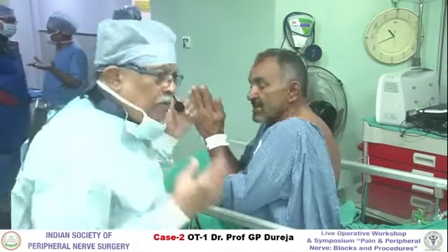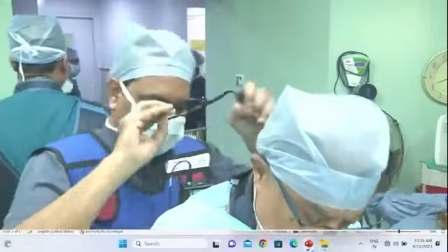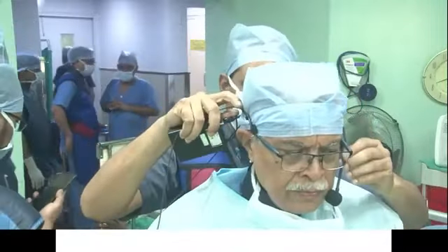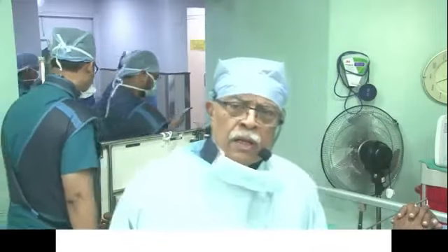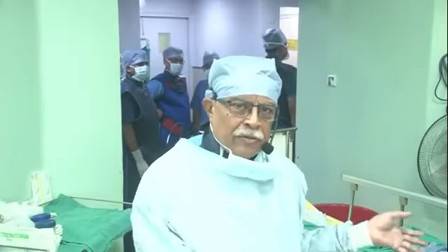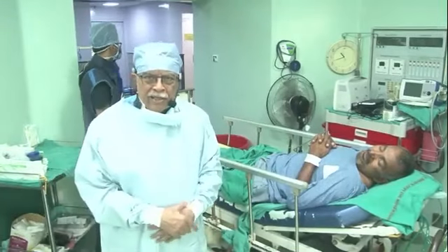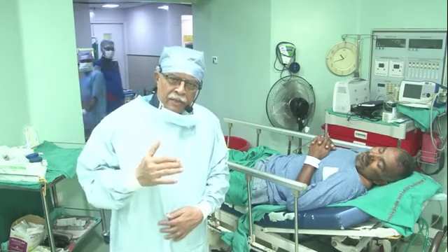Sir, when can we expect a peak effect of this? Dr. Dureja, one question is there: peak effect after RFA. When can we expect the peak effect to come, sir? See, normally the relief is immediate, like what you see. But sometimes there may be a patchy recurrence initially, and the intensity of pain will not come back. Slowly and steadily, within 2 weeks.